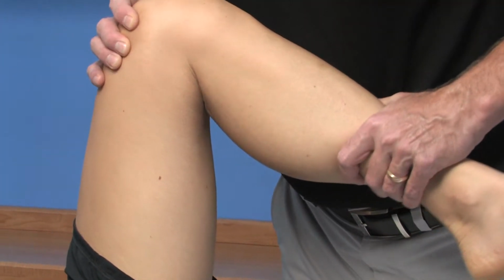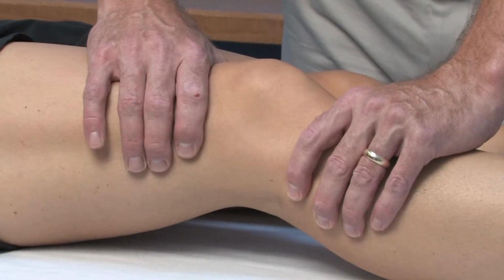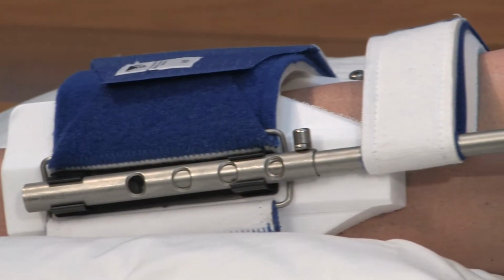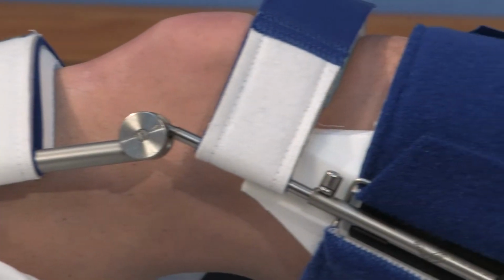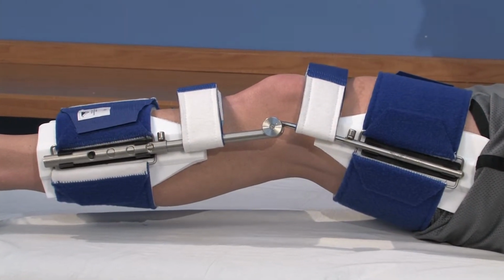When it comes to functional range of motion for the knee, some people say, you know, anything past 90 is great, and they all get focused on flexion. I really feel that extension is paramount, that if you have a straight knee, you're going to walk without a limp. Anyone with a bent knee is going to limp, and I think that the extension is really important, that Dynasplint can help us. But first and foremost, I concentrate on getting that person to at least 0 degrees of full extension.